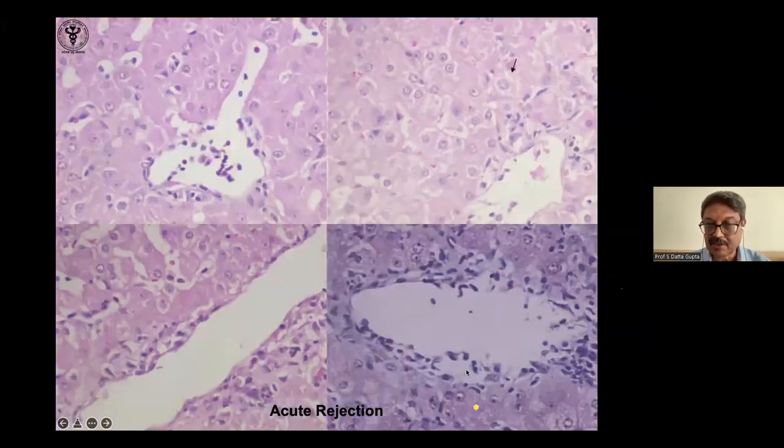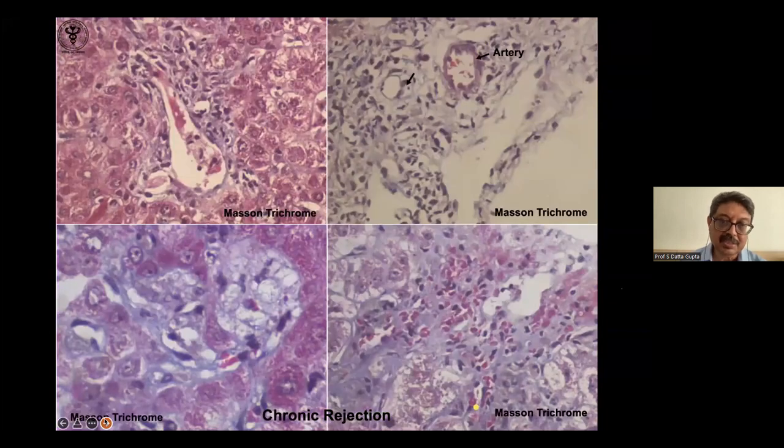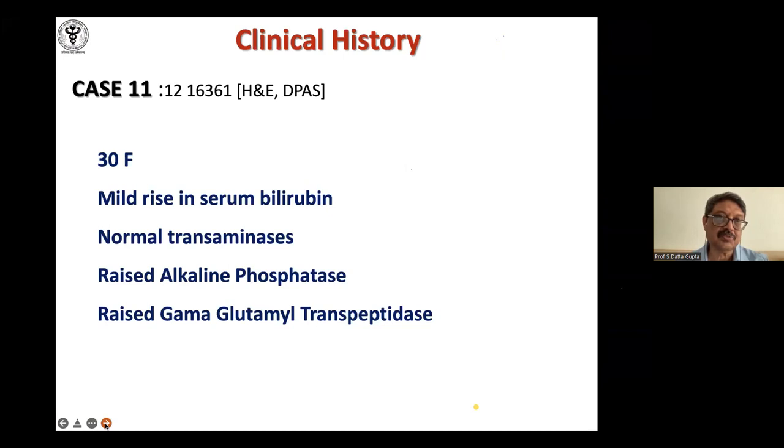Look, a lot of endotheliitis. You can get cholestasis. Look at this endotheliitis. So this was mainly to show you what you get in acute rejection. You can get ballooning, you can get cholestasis. And in chronic rejection, of course, you can get paucity of bile ducts and foamy histiocytes, and because basically there's loss of bile ducts, it looks like obstruction and so on.